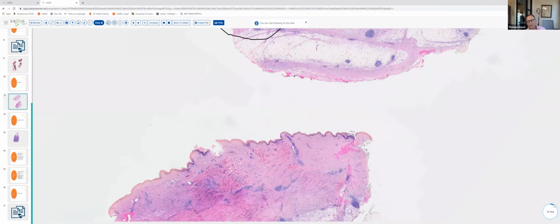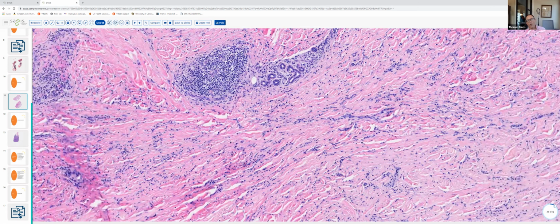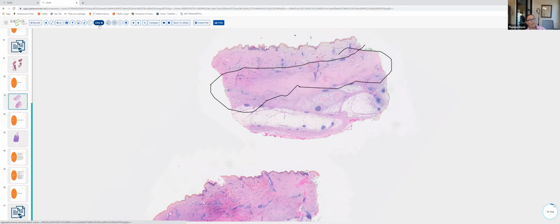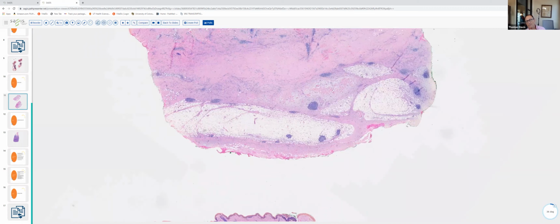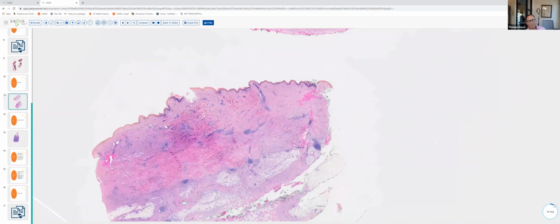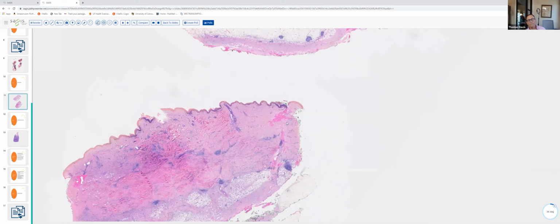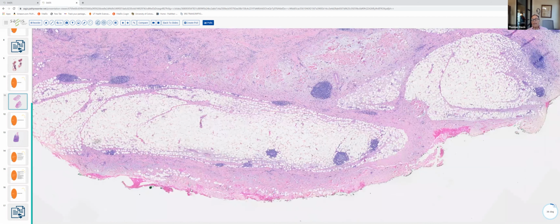And in those zones, if we go down and take a look, one can see that the sweat glands are bound down, which is what we see in morphea, with loss of the surrounding subcutaneous tissue. This particular variant of morphea is an inflammatory expression. It's got a little bit more robust lymphoplasmacytic infiltrate. And one can see that the sclerosis in this case is extending into the subcutaneous tissue. And morphea, like necrobiosis lipoidica, when it affects the subcutaneous tissue, gives one a septal rather than a lobular paniculitis with sclerosis involving the fibrous septae. And one can see, of course, extension of the sclerosis quite deep, even down to and involving the fascia, of course, in cases of Shulman syndrome or eosinophilic fasciitis.